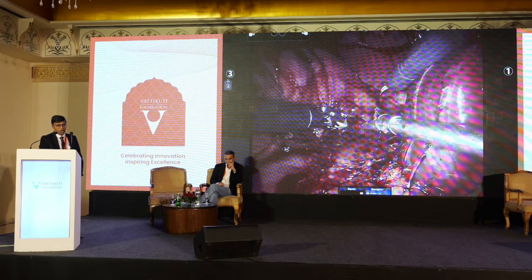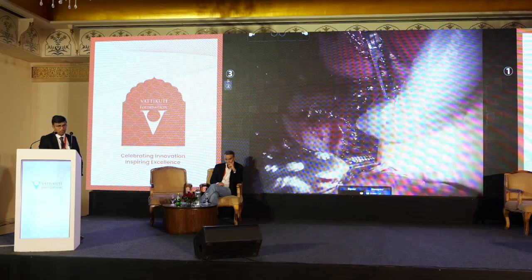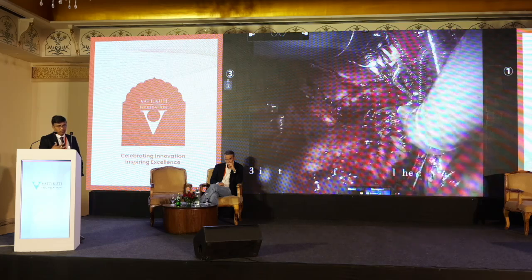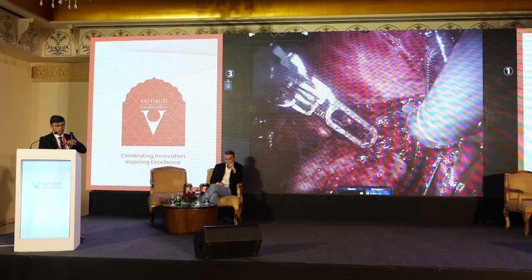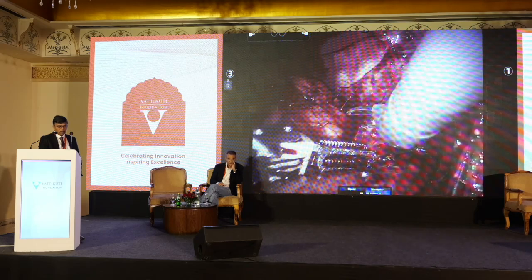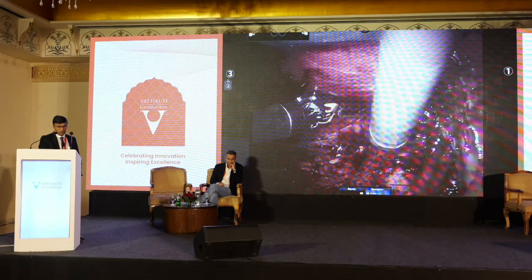These are big collaterals and they cause torrential bleeding and loss of confidence. So they will be very carefully dissected and clipped. Here I would say one tip: the fourth arm acts as a very good retractor. You can see the fourth arm retracting right above the IVC, the caudate lobe, and giving access to the subhepatic space. Again, the caudate vein is seen, a small vessel which you can clip. Here you see the bigger caudate vessel, so that has to be clipped.